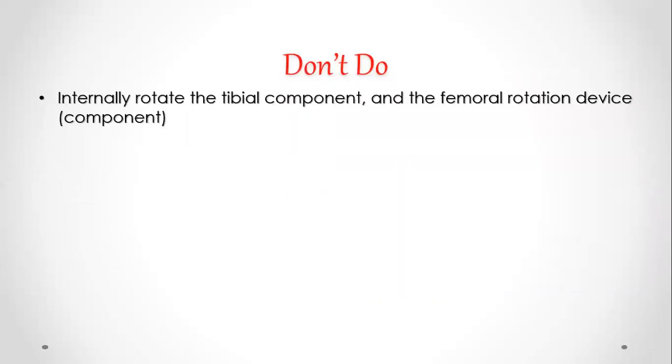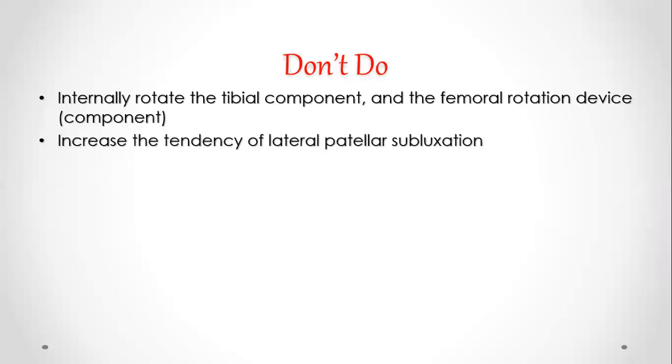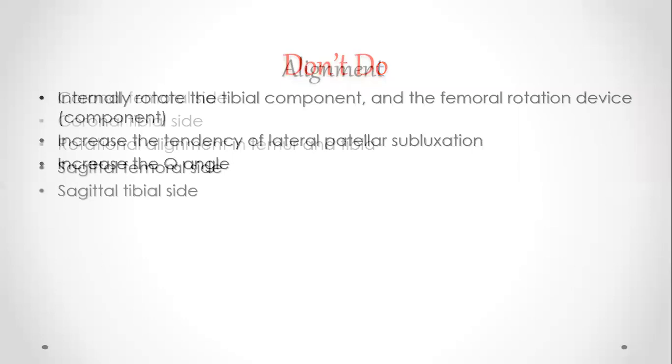So please don't do internal rotation of the tibial component and internal rotation of the femoral component together, because these components will affect the patellar tracking, and failure will be early. They increase the tendency of lateral patellar subluxation and increase the Q angle, as you will see in the next talk.